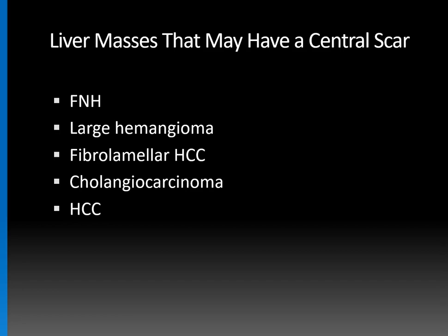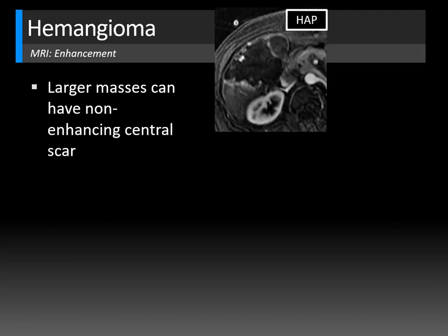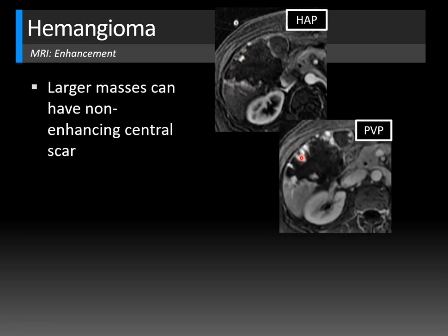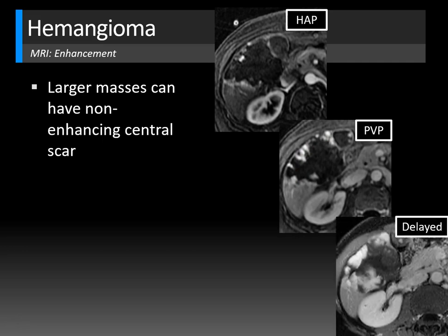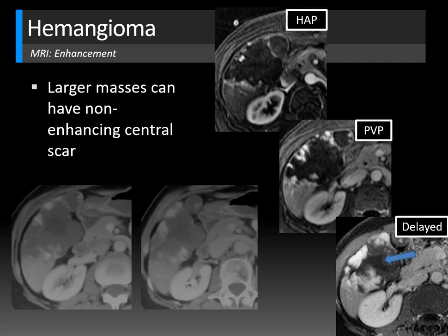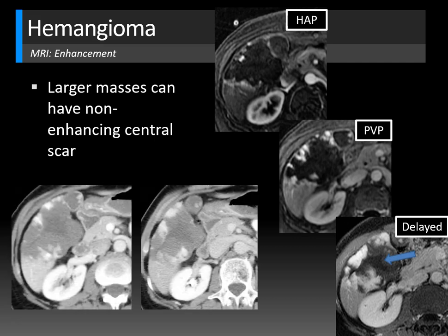For bonus points: what Disney movie has a central scar? Yes, The Lion King — central character Scar! Just like on CT, these central scars are typically non-enhancing on MRI. Post-contrast series show peripheral nodular puddling on arterial phase, progressing centripetally on portal venous and delayed phases, but the central scar remains non-enhancing and T1 hypointense. The correlative CT scan confirms the central scar is non-enhancing.